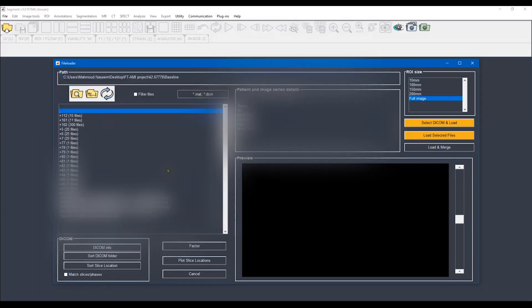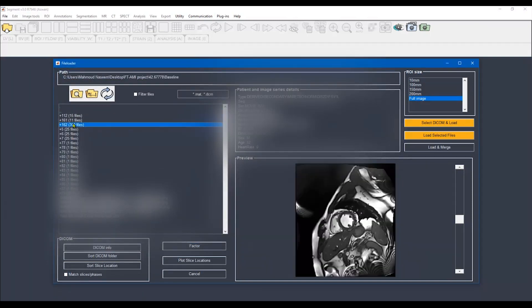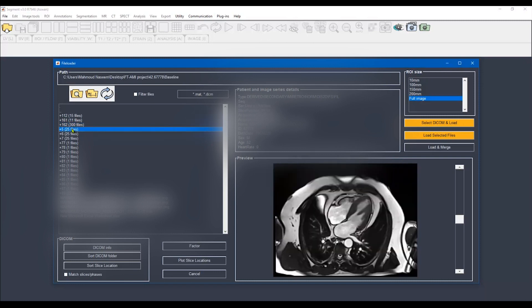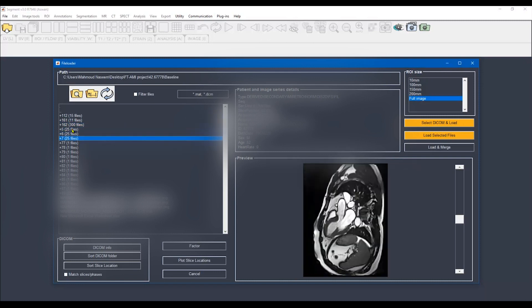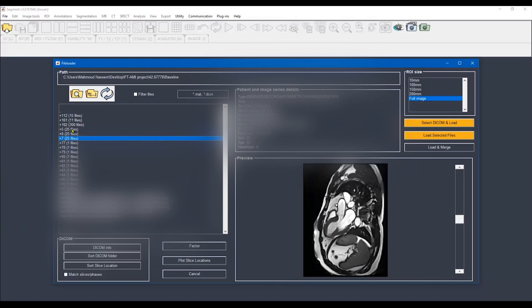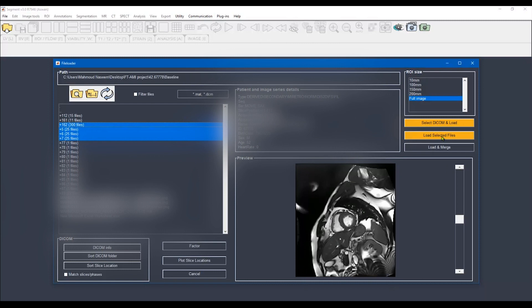To perform feature tracking you have to have cine short axis slices covering the whole ventricle in order to perform the circumferential and radial strain, and also to have the three long axes — the four chamber, two chamber and three chamber — in order to perform the longitudinal strain. I'm going to select all these files and then load selected files.